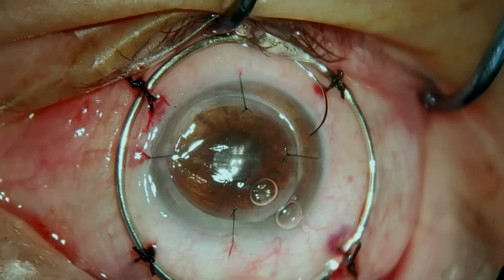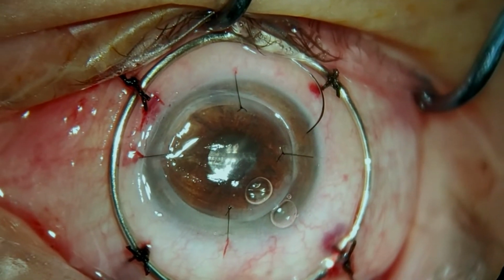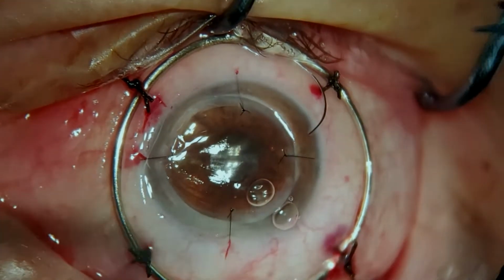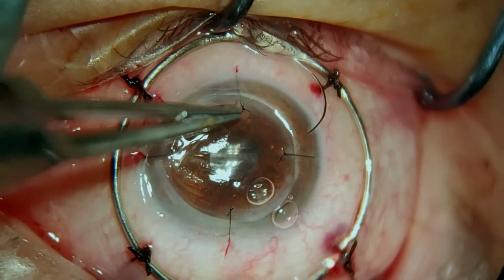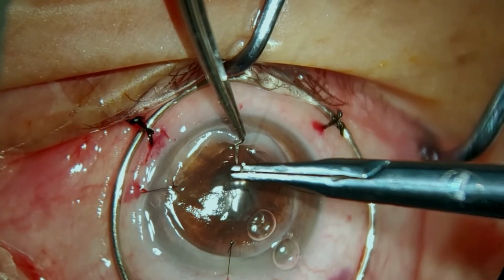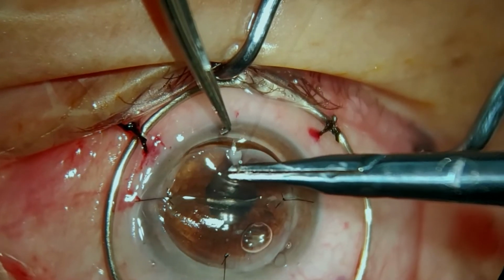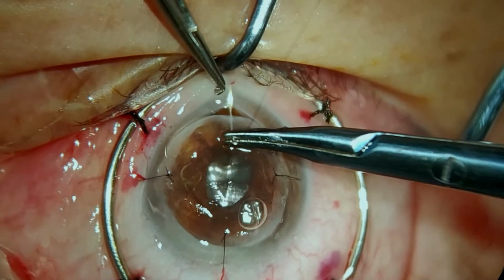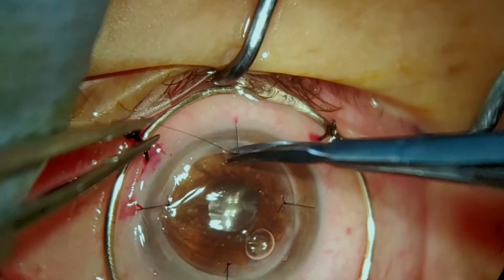Now we have the 4 sutures in place, and we don't like the one at 6 o'clock because we feel it's not radial enough. It looks like it's a bit to the right centrally. So we just remove it and replace it. It's better to replace it sooner rather than later, because the impact on the astigmatism is greatest at this point, before other sutures are in.